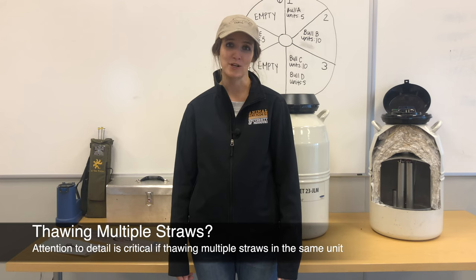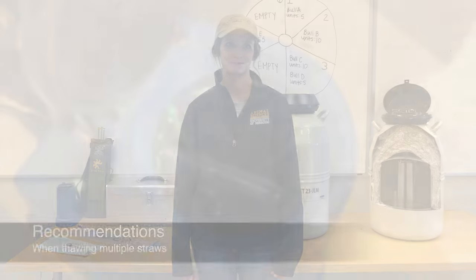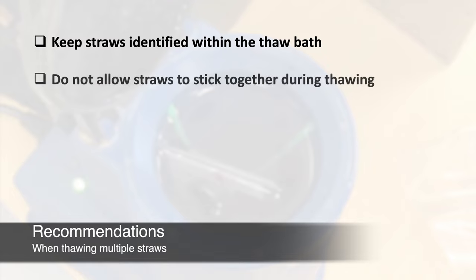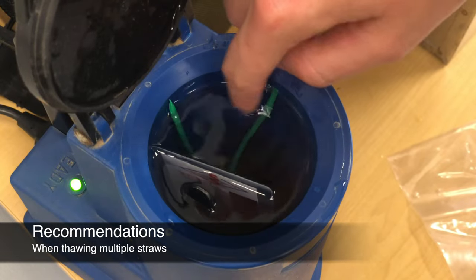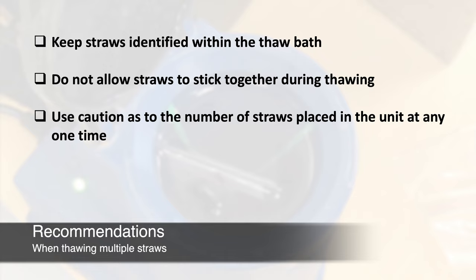Multiple straws can be thawed at once, but attention to detail is critical. First, it is critical to keep straws identified within the thaw bath to avoid confusion or use of the wrong straw. Second, straws should not stick together in the thaw unit, as this can cause uneven or incomplete thawing. Third, use caution as to the number of frozen straws placed into the unit at any one time, as each straw is essentially an ice cube that can temporarily cool the water. We recommend thawing no more than three straws in a single thaw bath at any one time.